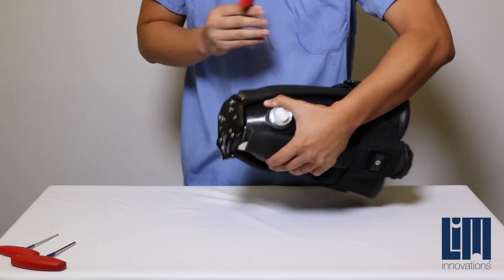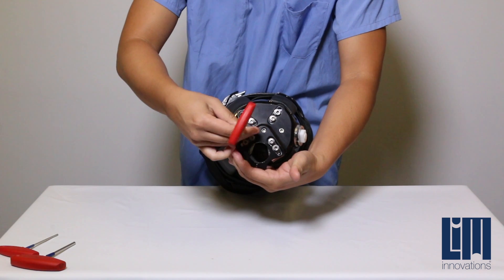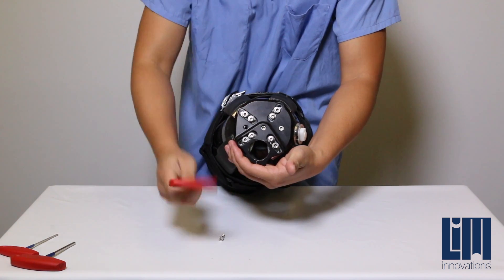Using the 4mm wrench, you can remove all three screws as well as the spacers and set those aside to easily locate them later for installation.